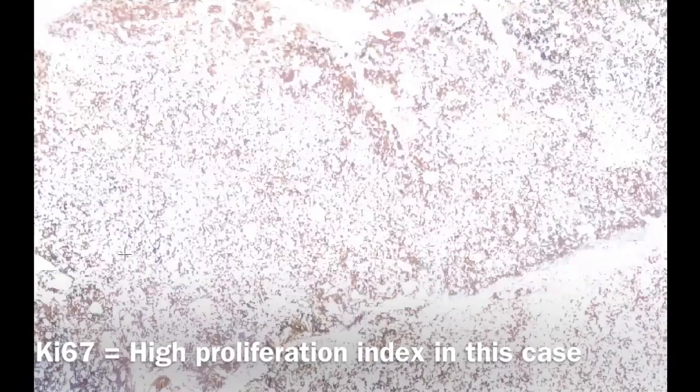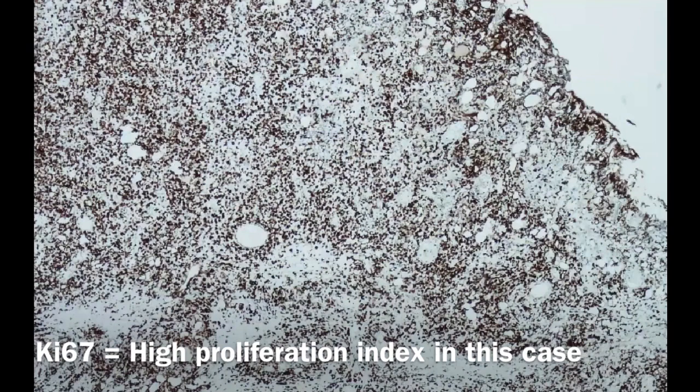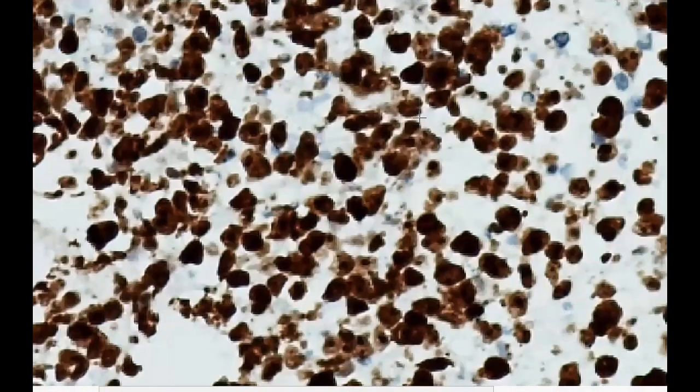This is the last stain — the Ki67 — to see the proliferation index. From the morphology, I suspected it would be high, and indeed it's very high. We consider it to be approaching 100% for these large atypical cells. The Ki67 is clearly staining these large cells. For the HANS classification, we look at BCL6, CD10, and MUM1. We classified this case by HANS criteria as non-GCB diffuse large B-cell lymphoma.